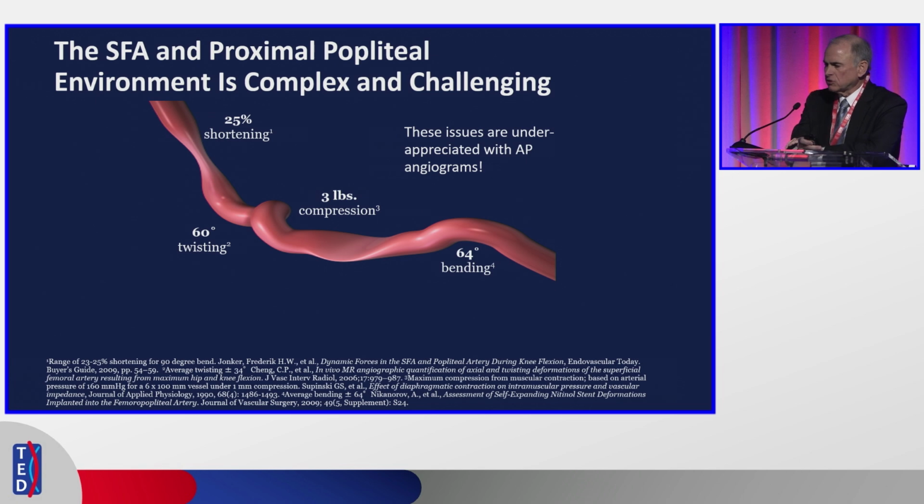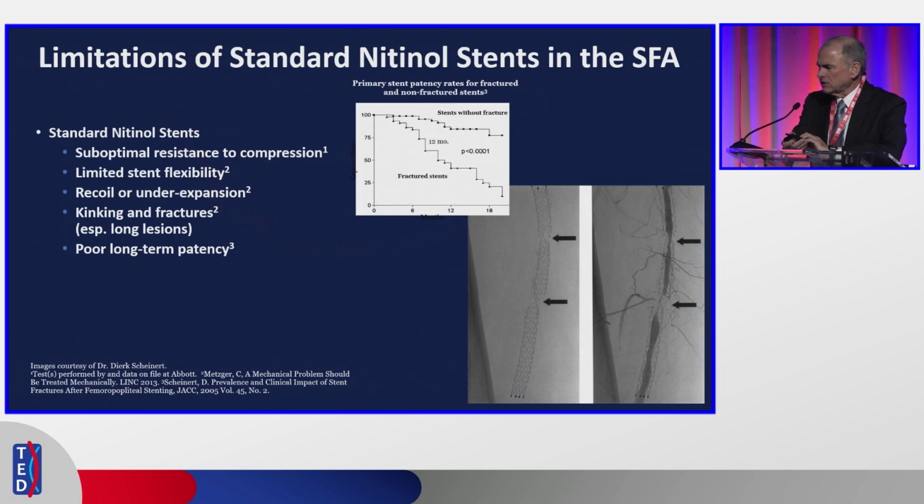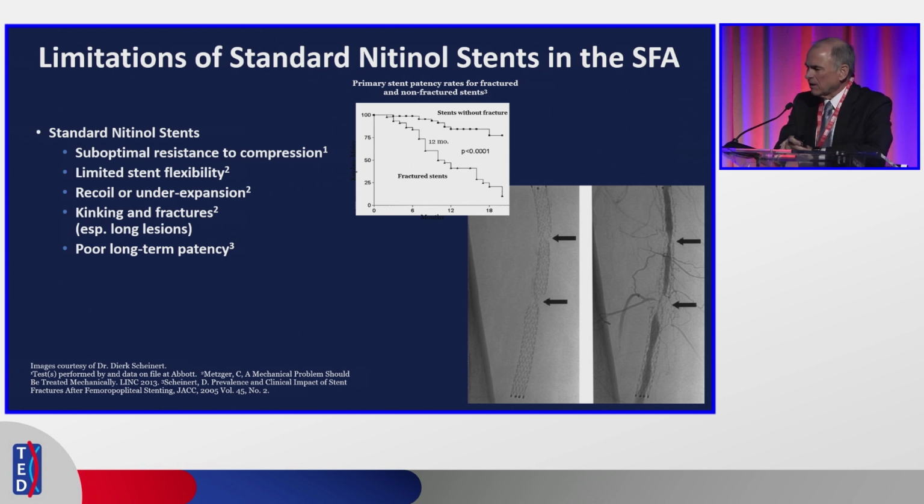Now, as Sonia showed you earlier, this is a very complex environment, and that leads to problems such as stent fractures. When David Ali and I published the very first article on stent fractures in the SFA, we got hate mail. People were saying, you're trying to ruin this field. And no, we weren't. We were trying to point out a real problem. And these just speak about some of the problems.